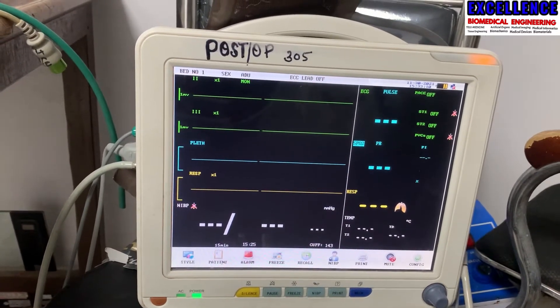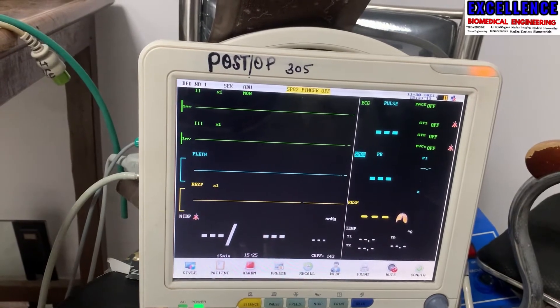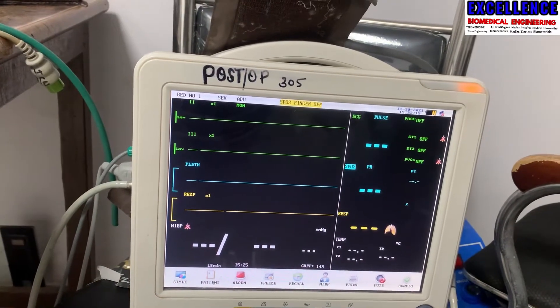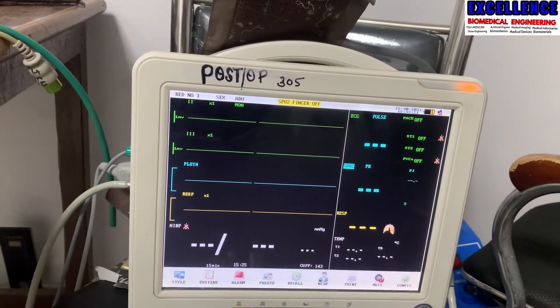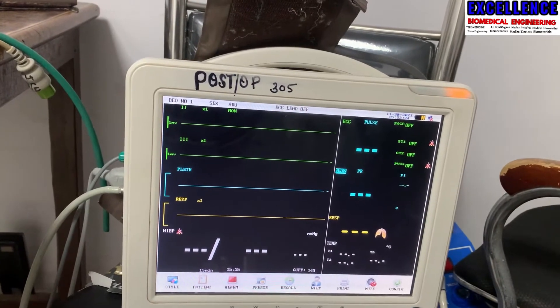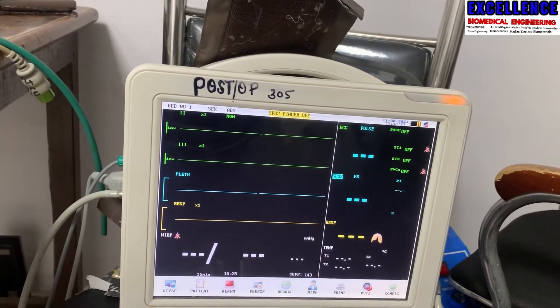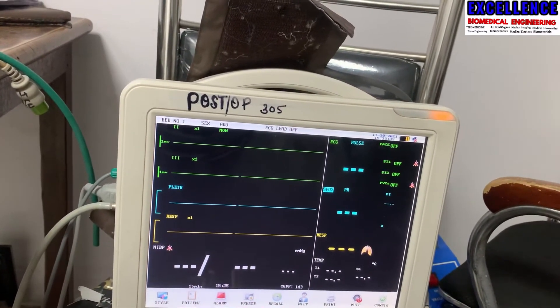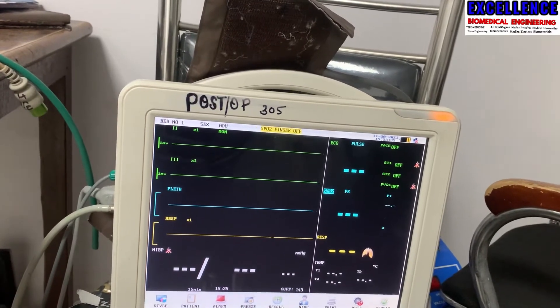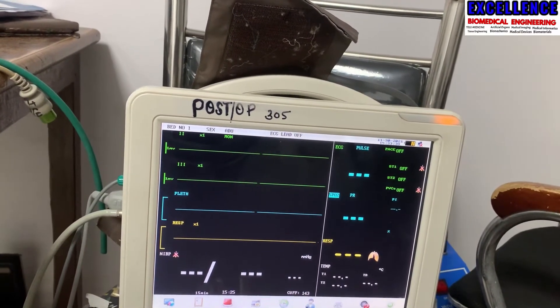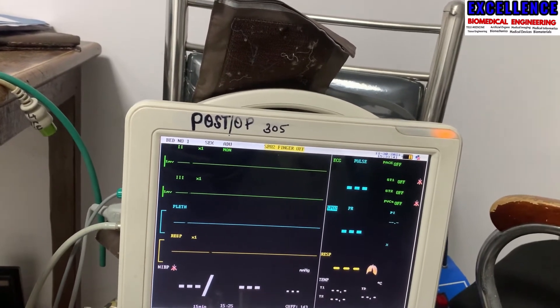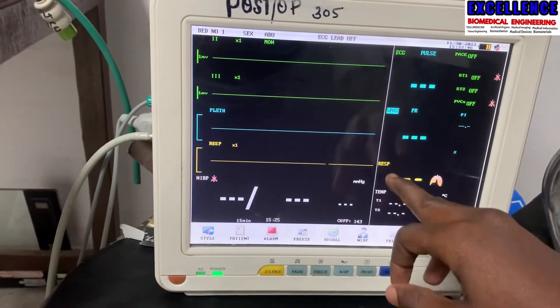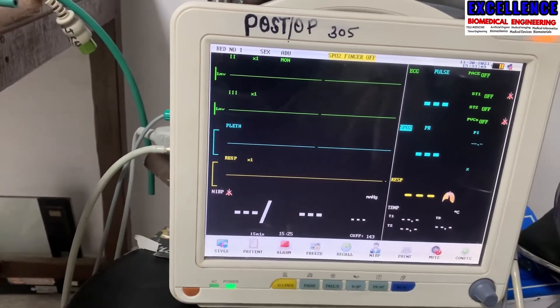Multi-parameter is just an abbreviation of multi-parameters. The parameters that doctors need to monitor constantly are the vital signs — like SpO2, which is oxygen saturation, respiratory rate, ECG, and blood pressure. Any monitor that measures more than one parameter is called a multi-parameter monitor. As you can see, this monitor measures ECG, SpO2, respiratory rate, temperature, and non-invasive blood pressure.